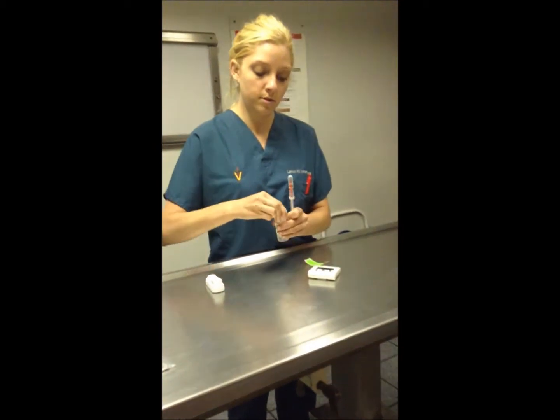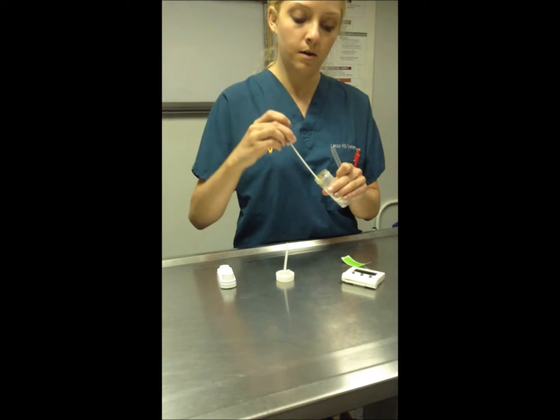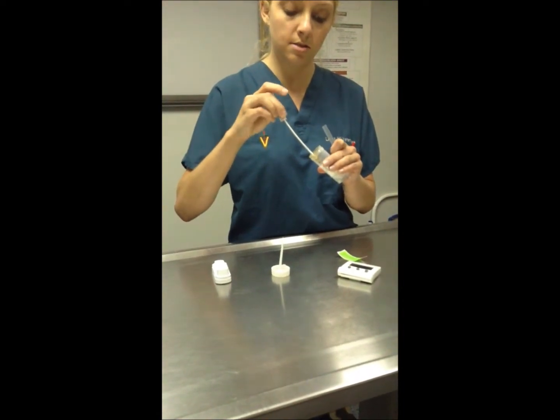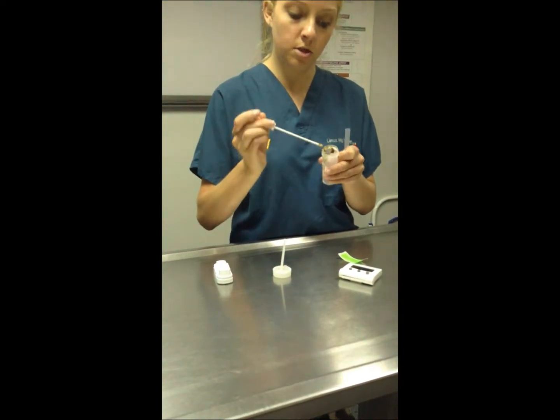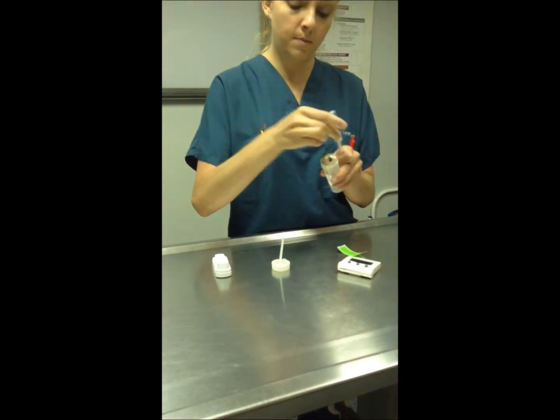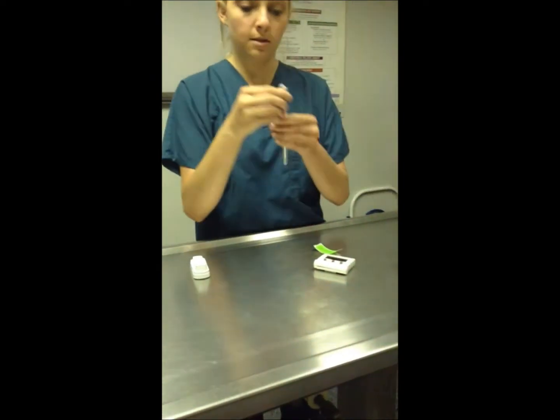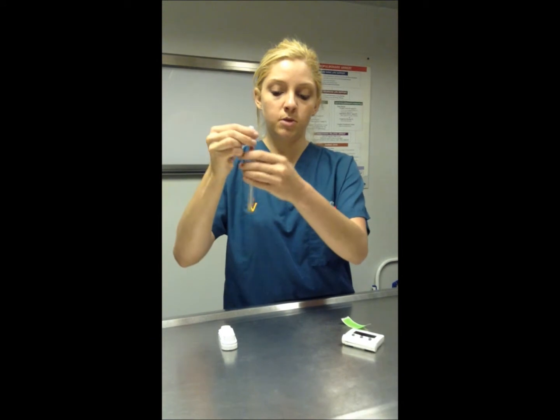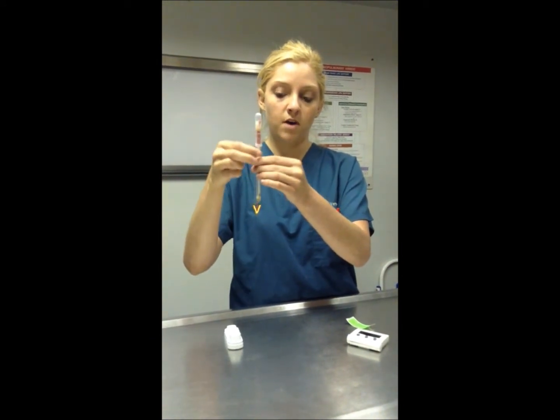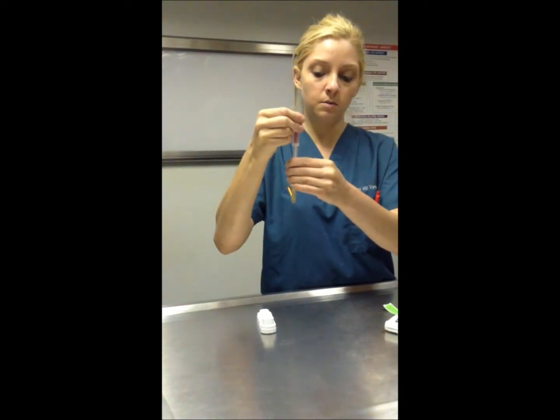So what you're going to want to do is just put a little bit of stool on the tip of the Q-tip that's attached to the solution. You want to make sure there's no chunks on there. You're going to stick it back in. Put the lid back on this, because this has to be going to the lab. And you basically move this piece back and forth so that it snaps, and you squeeze it to put the solution into the vial so that it mixes with the stool. You want to make sure you get it mixed really well.